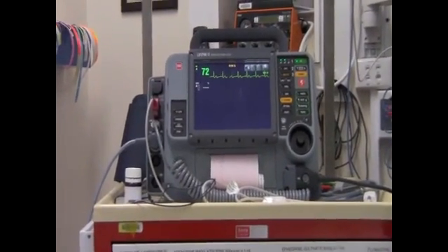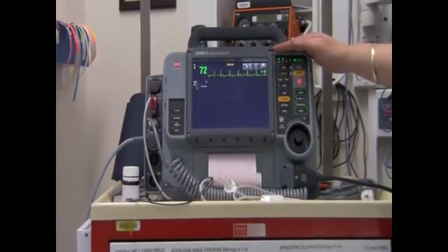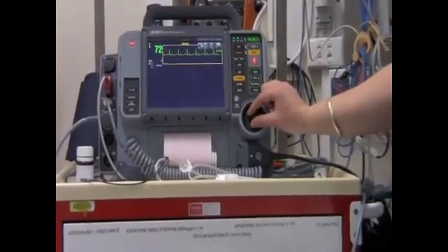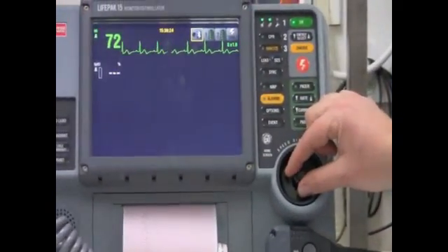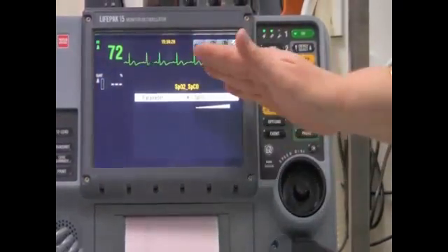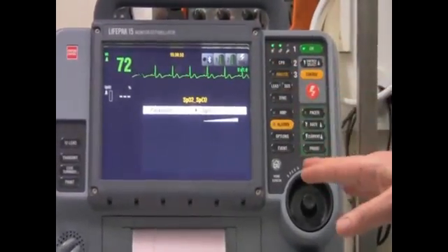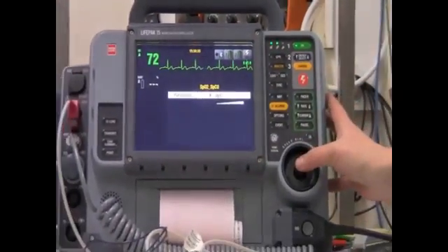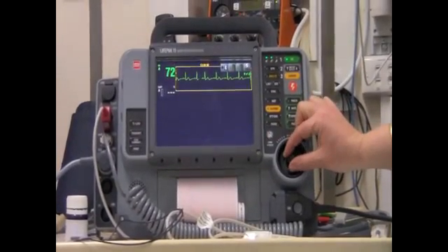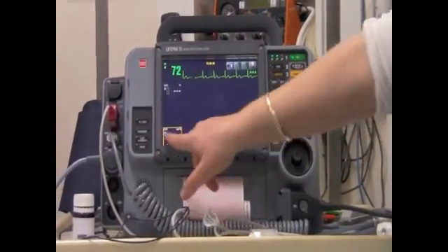Okay, so if we just go back to basic monitoring now of our patient. The screen can be manipulated by using the selector knob. So you twist it to wherever you want on the screen, and then if you push it in and select it, you can change the alarms, you can change whether you have a volume with each heartbeat, all of those kinds of things. So that's just a matter of playing around with and adjusting it to what you want it to be.